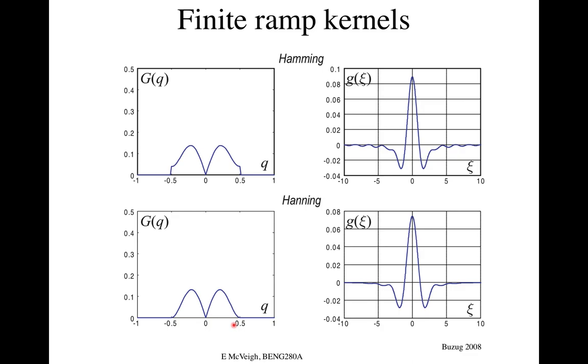From my understanding, radiologists a lot of times see the images post acquisition, not necessarily while it's happening. If that is the case, can these filters be applied after data acquisition? So essentially the data is acquired through CT first, and then the filters can be changed based on what they're looking for. Correct. You can reconstruct the same raw data multiple ways, and have a high frequency picture and then a smooth picture for the radiologist to look at.